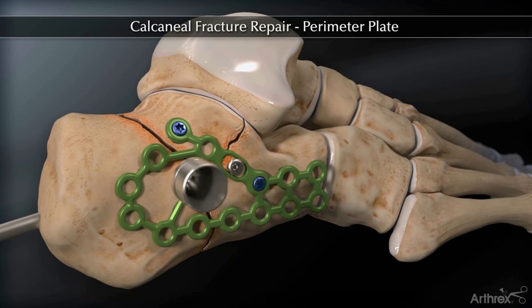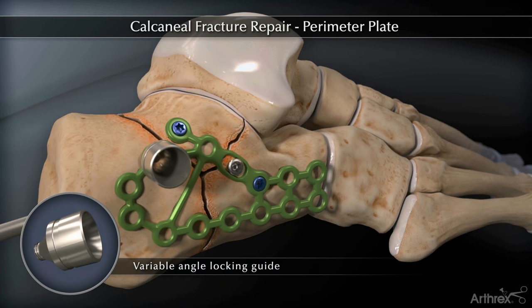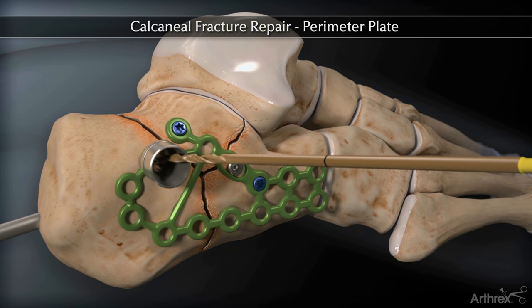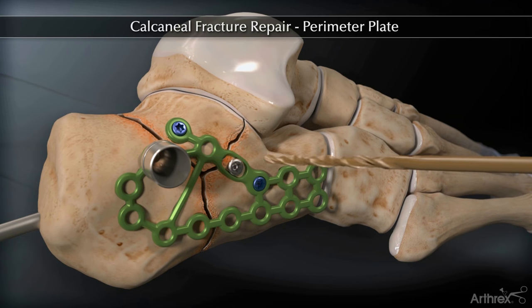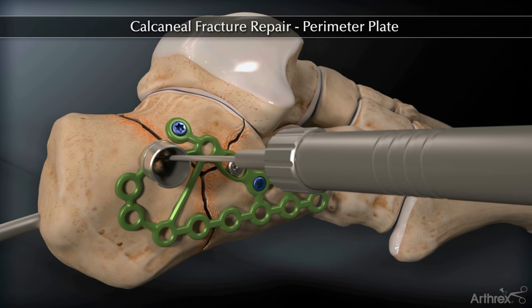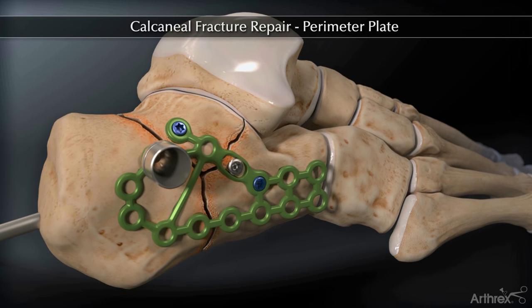Variable angle locking can be achieved by inserting the VAL guide into the appropriate plate hole. Using a 2.5 mm drill bit, the VAL guide will allow up to 15 degrees of angulation. Measure the depth with the device and insert the appropriate 3.5 mm locking screw.